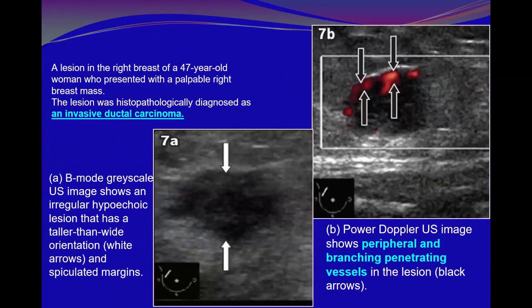In this example, an abscess sometimes can be seen like this. We have seen a lot of abscesses looking like this: irregular, indistinct, heterogeneous, deeply hypoechoic with some internal echoes. But still, cancer can look like this. So let us go to Doppler. This is not the pattern of abscess vascularity.